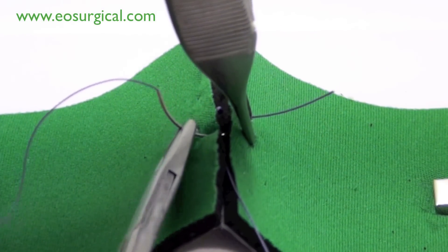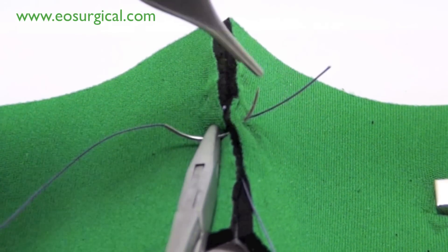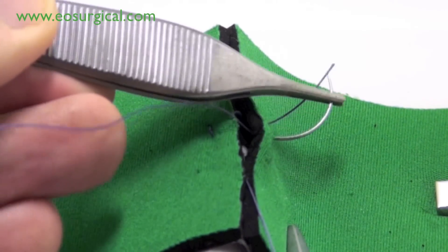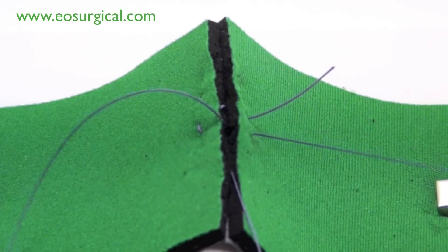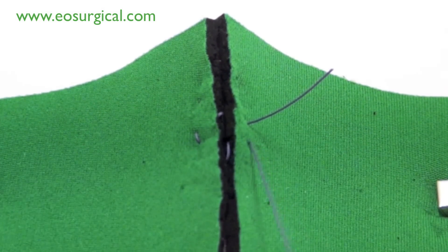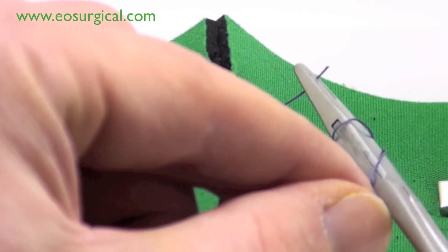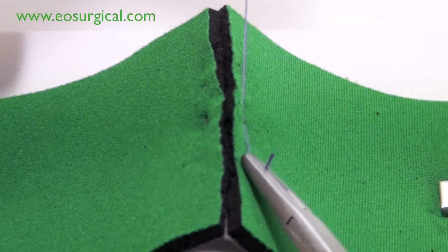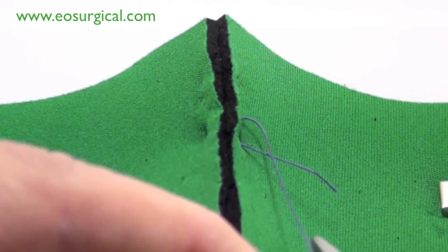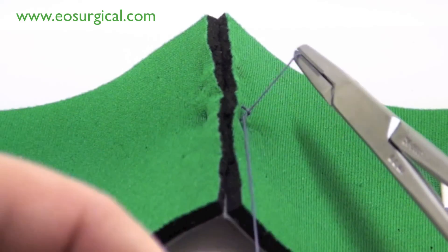Finally, to exit at point D. Then the suture is tied at this point. You will also see how the horizontal mattress causes the wound edges to evert up.